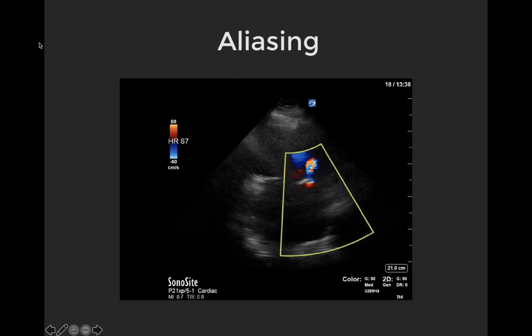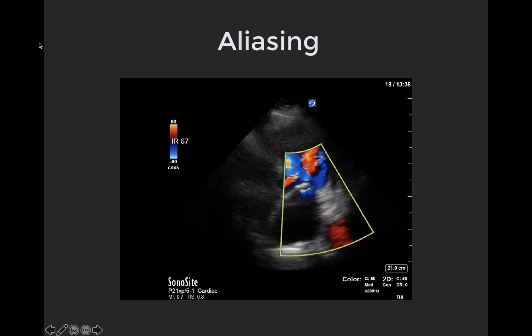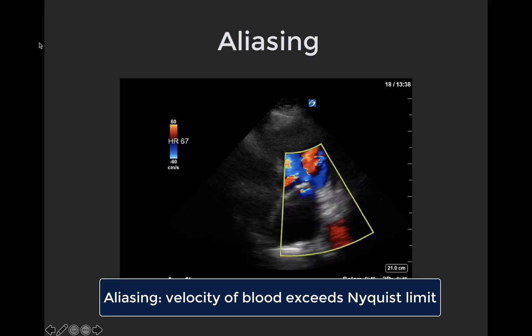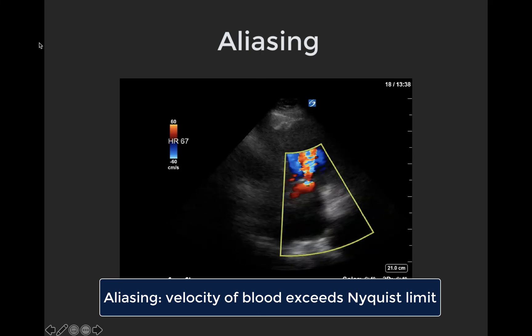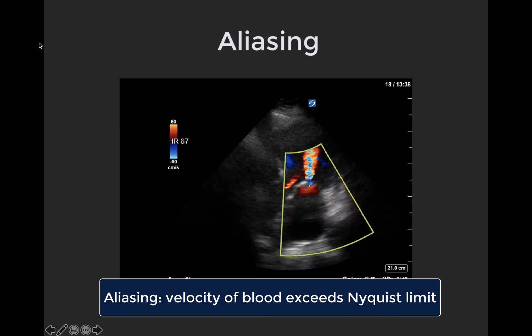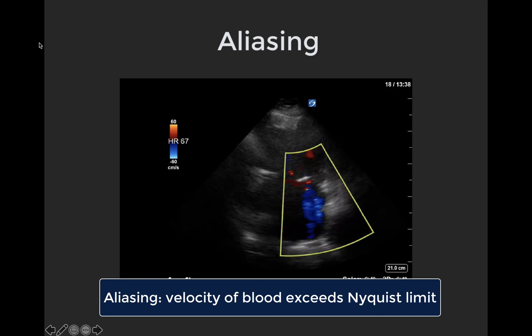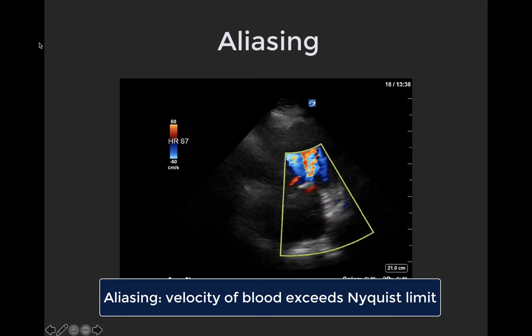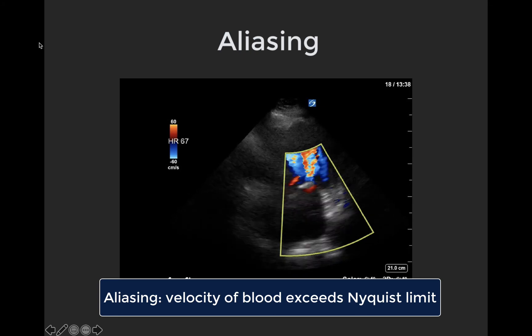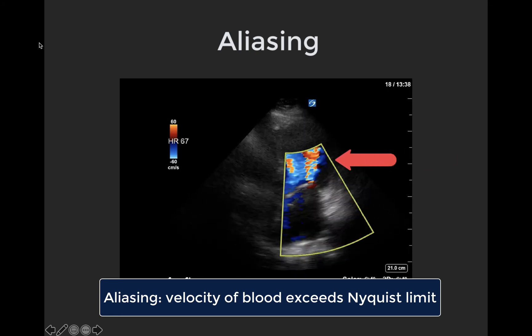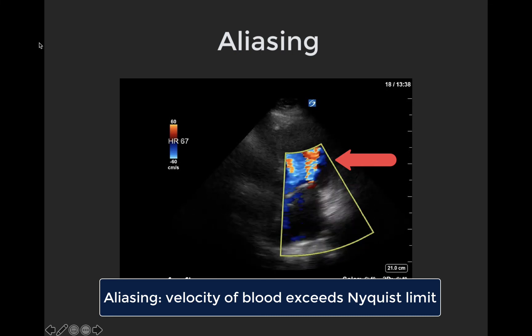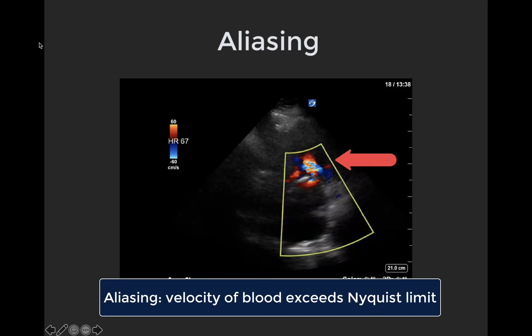A quick word about aliasing: aliasing is what happens when the velocity of blood being measured exceeds the Nyquist limit. With color Doppler, aliasing is represented by multicolored blue, red, yellow, and white flow, and is actually a useful thing to look for as it represents high velocity turbulent blood flow, which is often present with severe valvular disease. Here we see an example of aliasing through a stenotic mitral valve as a multicolored jet of high velocity turbulent blood makes its way through a restricted opening.